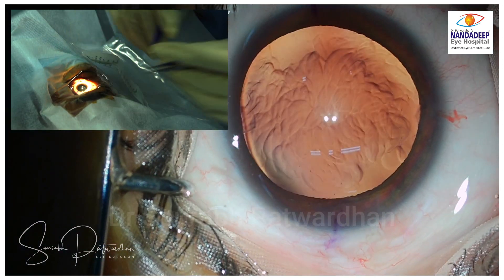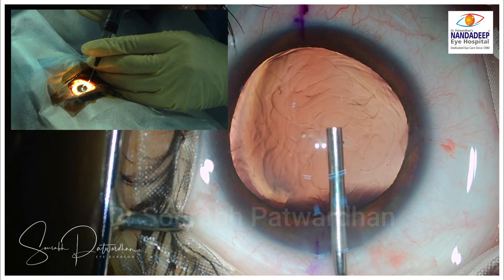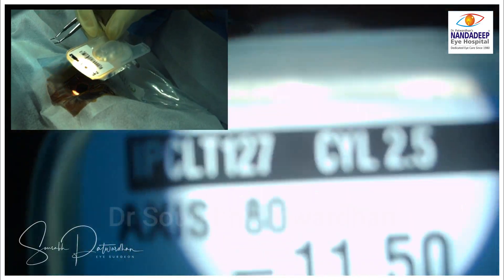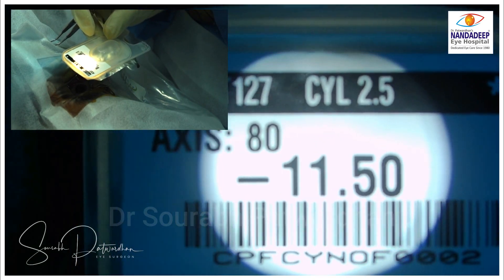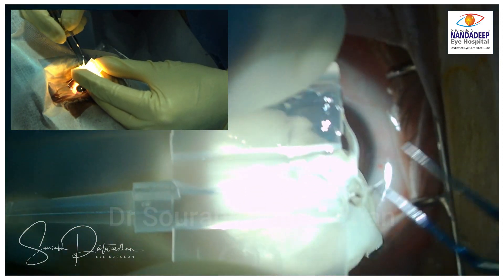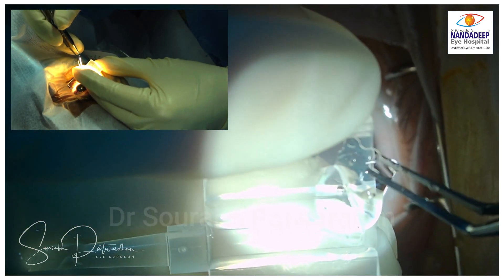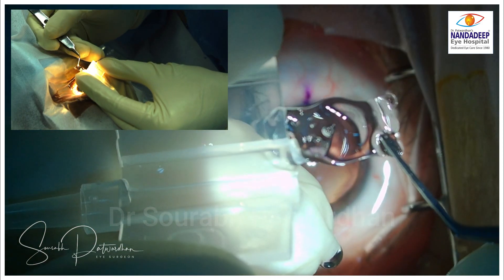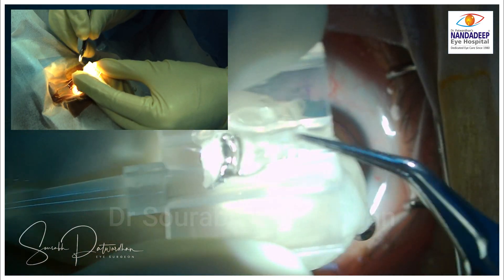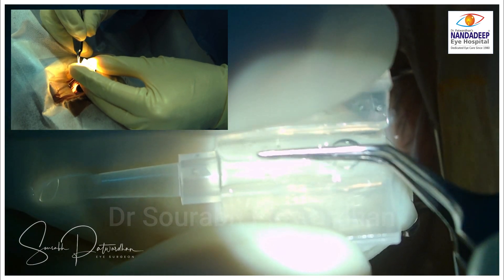I am putting intracameral xylocaine followed by 2% HPMC, and then taking the main temporal 2.8 mm incision. Because it is custom made for that particular patient, you can see the inner lip is slightly enlarged during the incision. This is the TORIC IPCL — it has multiple small openings which avoid pupillary block and improve flow between the anterior and posterior chamber. There is also a central hole which prevents pupillary block.